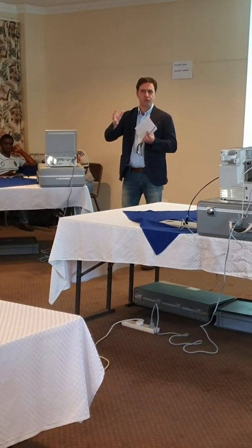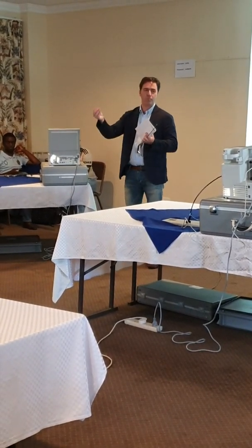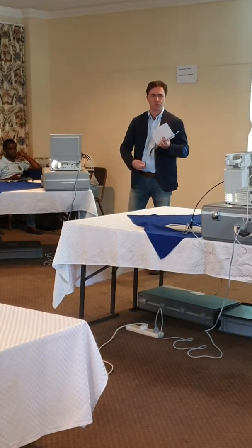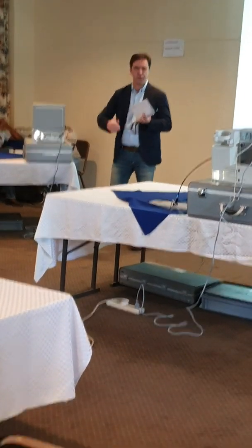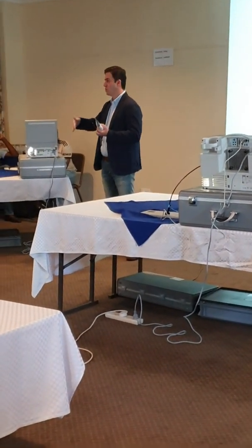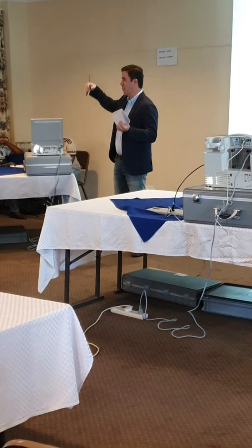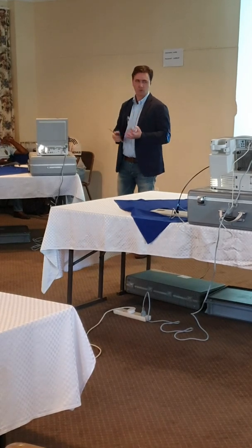This concept is really important because it will help us to plan ahead our incisions, and plan ahead where we're going to place our trocars. Normally, we use 2 lateral trocars and 1 suprapubic trocar to be really ergonomic, so you don't tire yourself if you're performing a long surgery. And also, when it's possible, define your correct incision to overcome this geometric problem that laparoscopy places to us, but with some tricks we can go further.